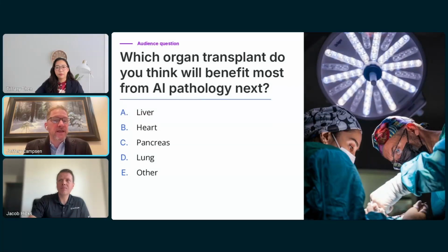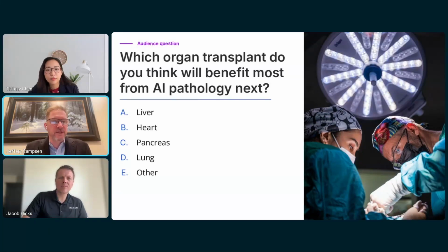In this particular case, there was not a pathologist available on site, so everything had to be transported out digitally, but also with the organs back to the centers. So this is real time. Why we're doing this, why we need this, is to really help facilitate getting all the data so that we can basically have the best organs go into the right patients.